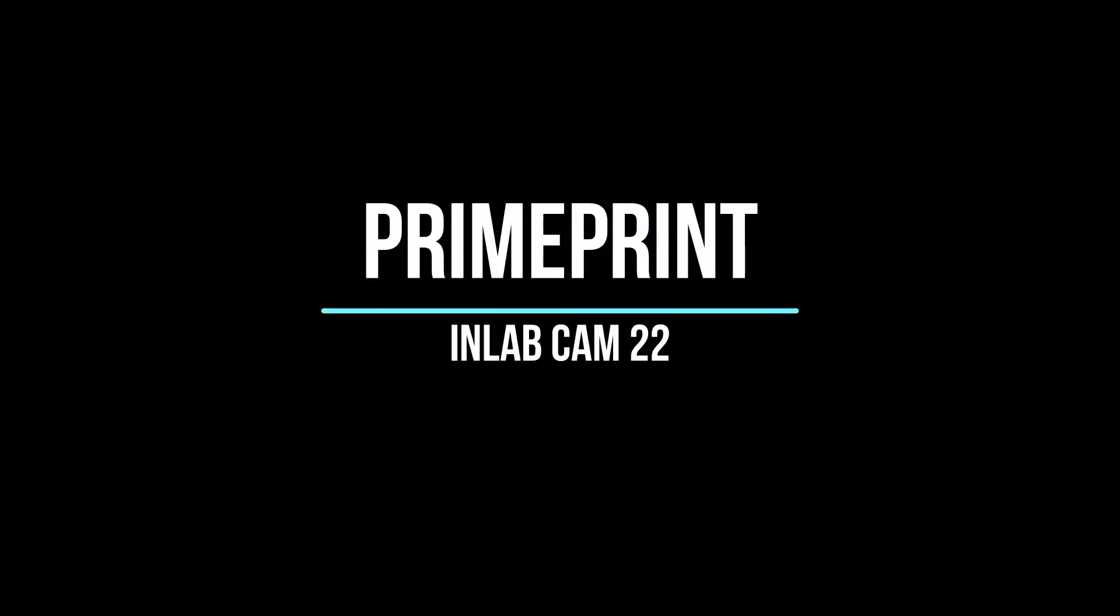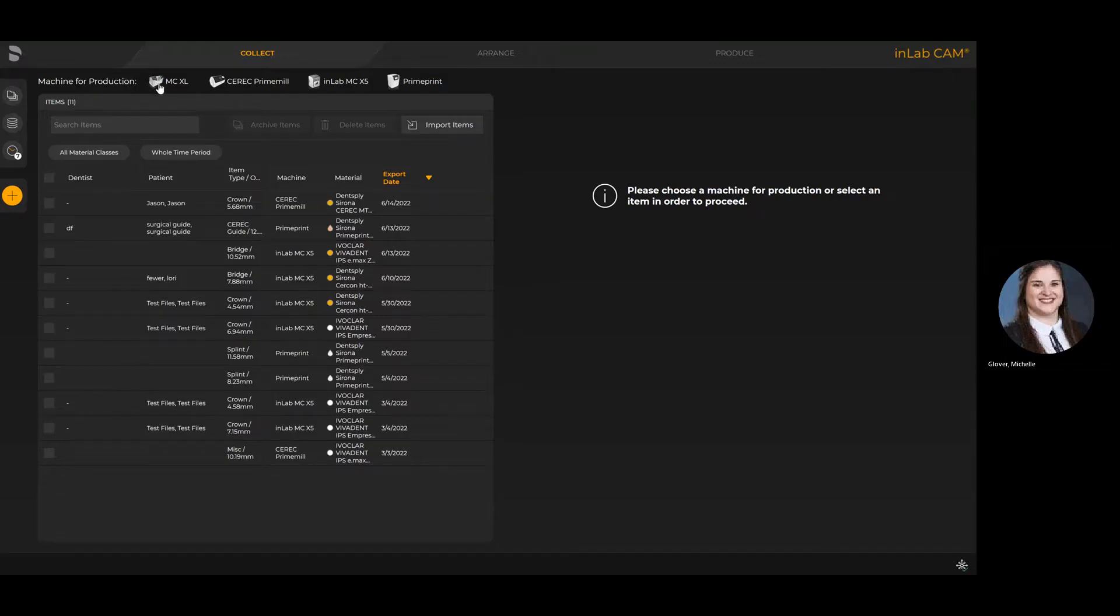Hello, today we are going to review the PrimePrint InLab CAM workflow.